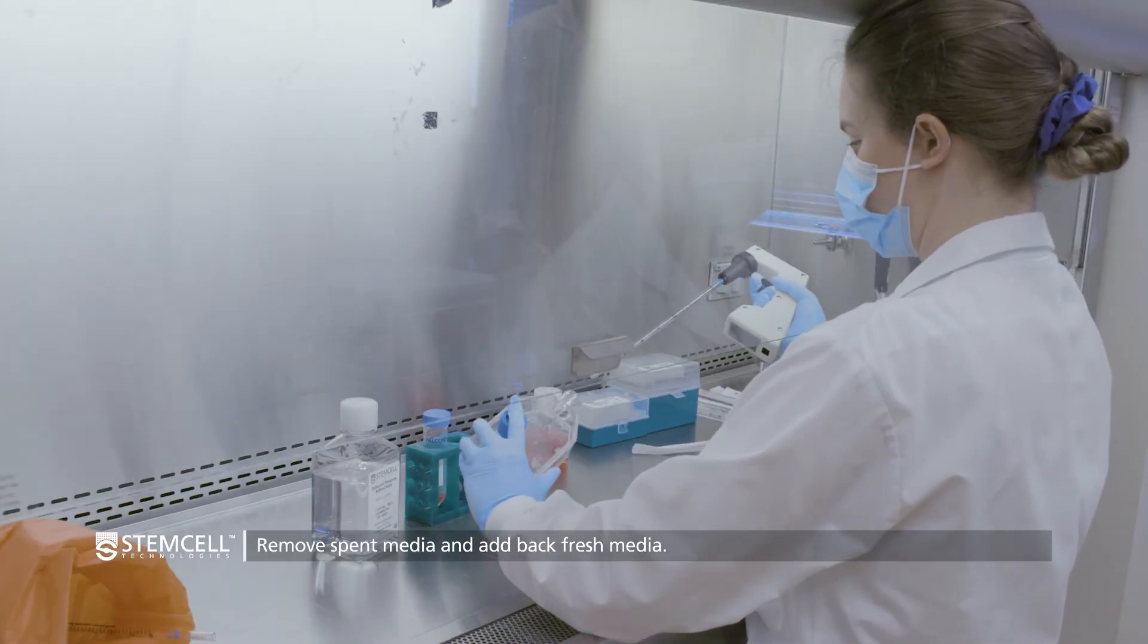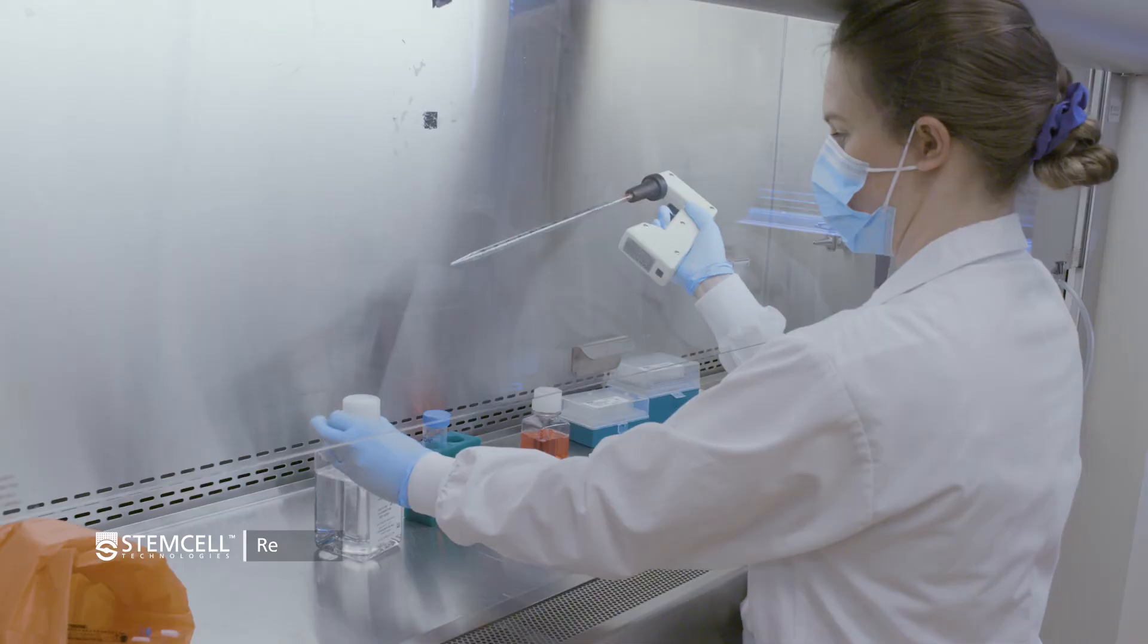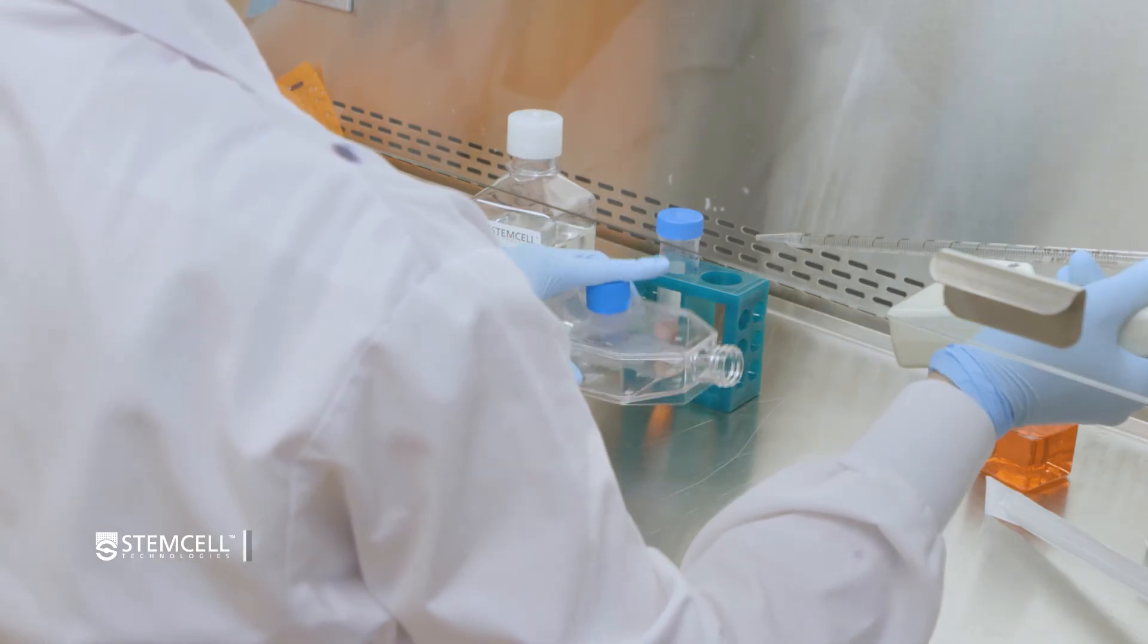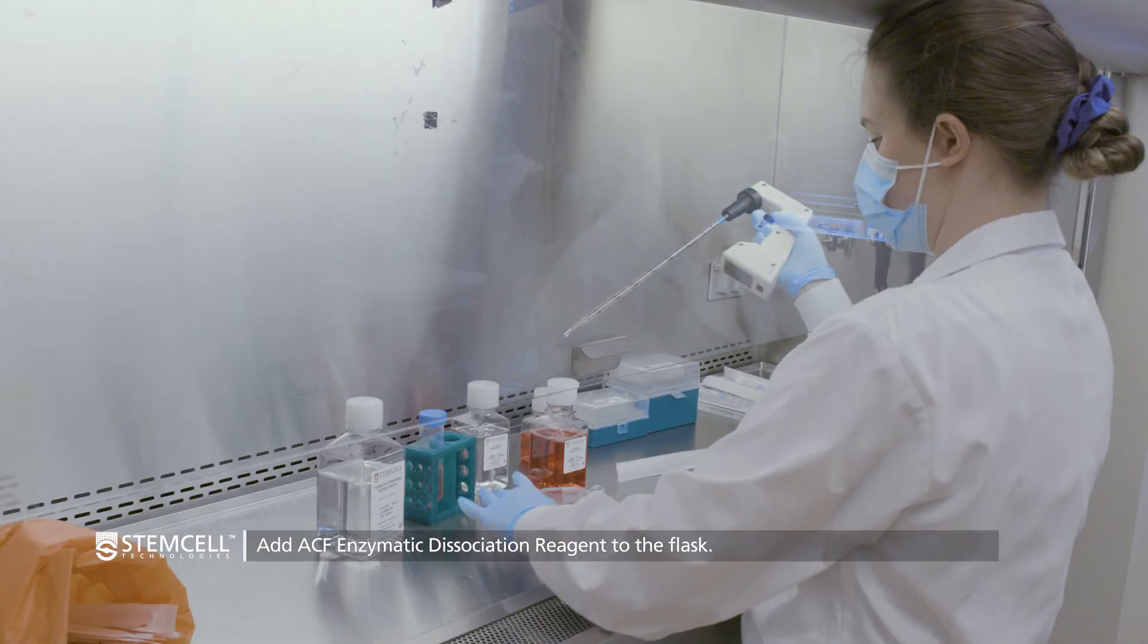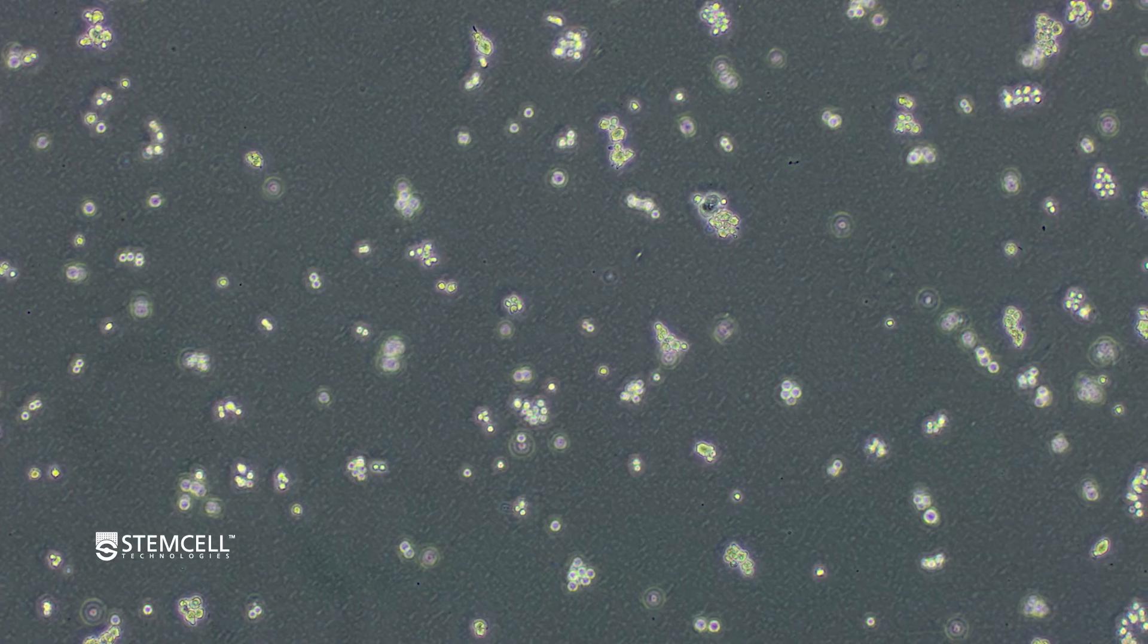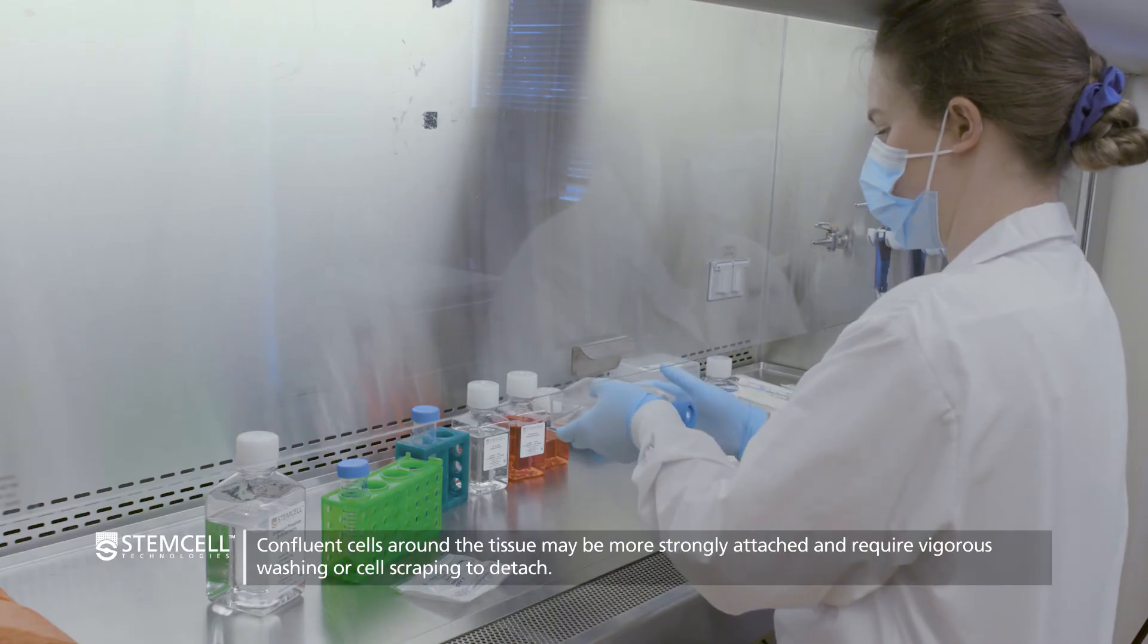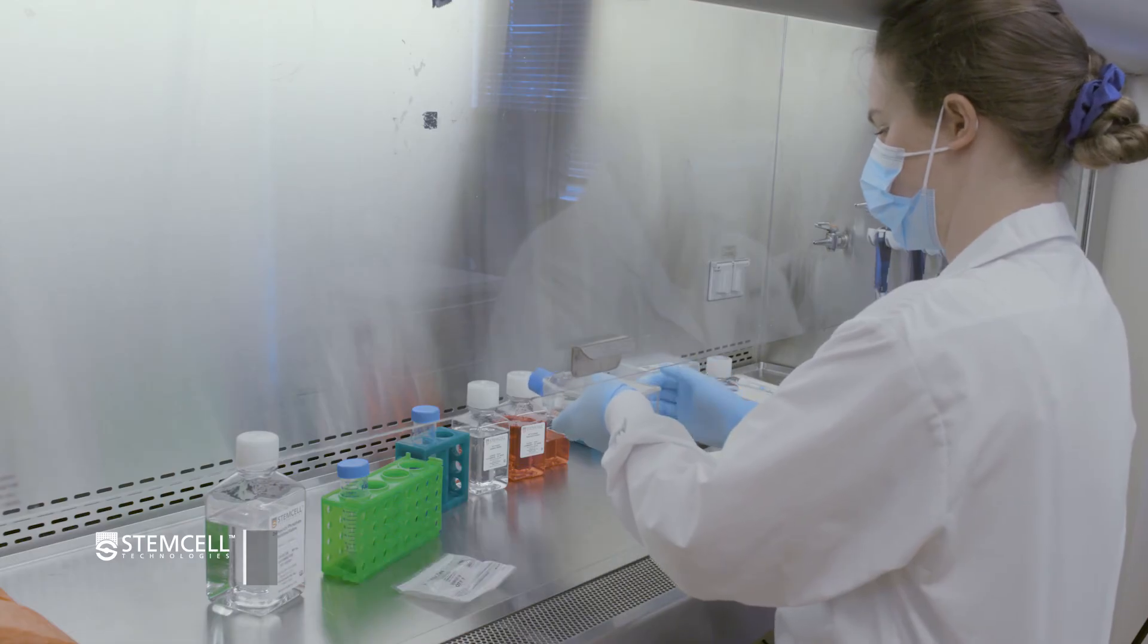To harvest the cells, remove all of the spent media and detached cells with an aspirator or serological pipette. Wash the flask once with PBS to remove any remaining loosely attached cells or tissue and the remaining medium. Add 5 ml of ACF enzymatic dissociation reagent to the flask. Incubate for 6 to 7 minutes at 37 degrees Celsius. Examine cells under a microscope to see if most of the cells have detached. Tap the flask vigorously to help with detachment. If cells are very confluent around the tissue, they may be more strongly attached and require vigorous washing or cell scraping to detach.